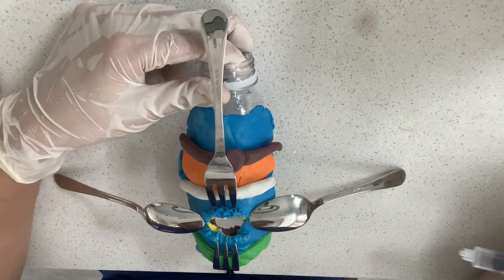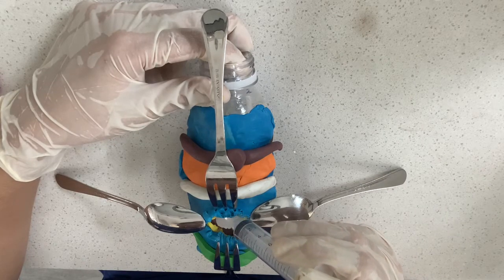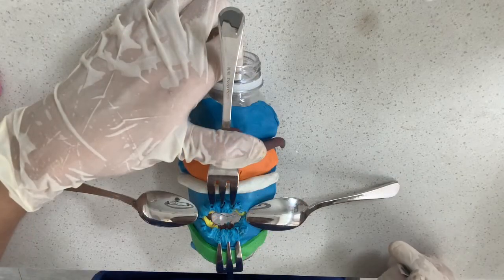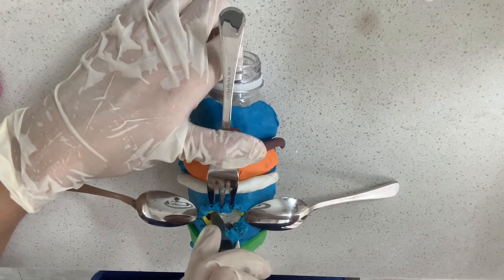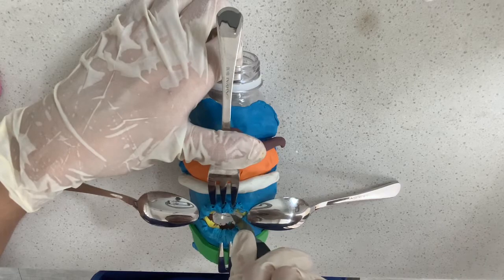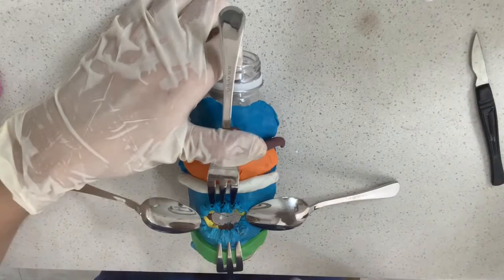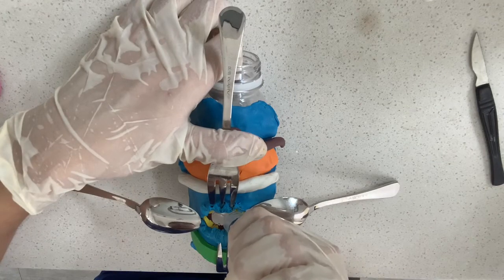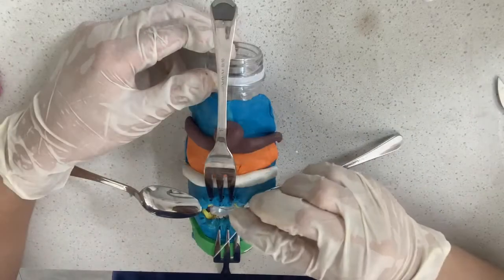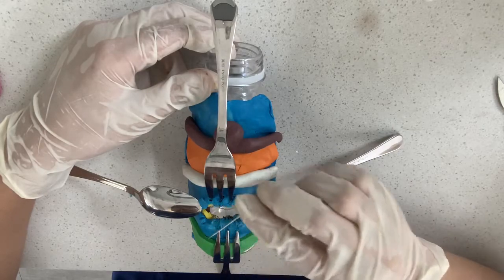In the awake patient, inject lidocaine into the tracheal lumen prior to incising the trachea and inserting the tube to reduce coughing. The safest tracheostomy in adults is to create an inferiorly based flap raised from the anterior wall of the third and fourth tracheal rings. Blood is suctioned for appropriate visualization of the trachea. A silk traction suture is passed through this anterior tracheal flap and loosely secured to the skin.